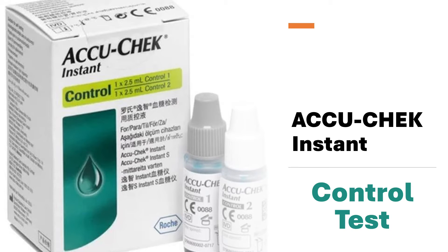Hi, this is Josh, pharmacist with Learn Blood Sugar Testing. We're going to discuss AccuCheck Instant, the control solution, how to perform a control test, and when you should.